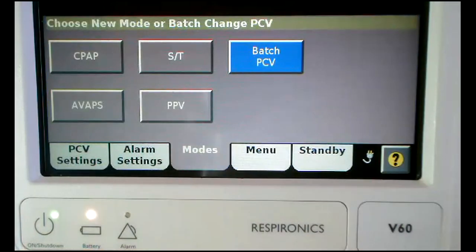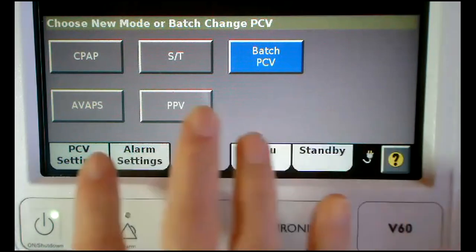All modes on the V60 Ventilator are pressure modes. All modes are approved for invasive and non-invasive use.